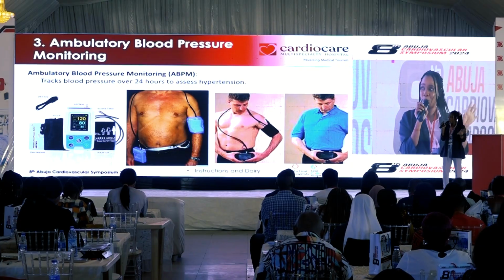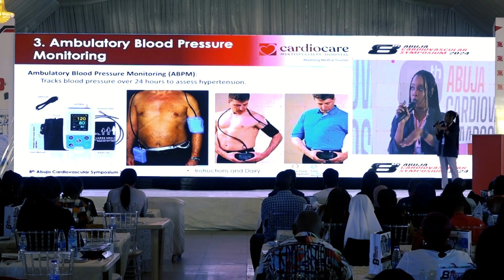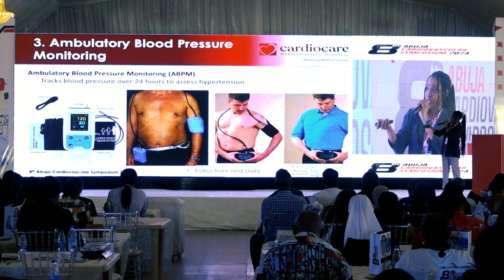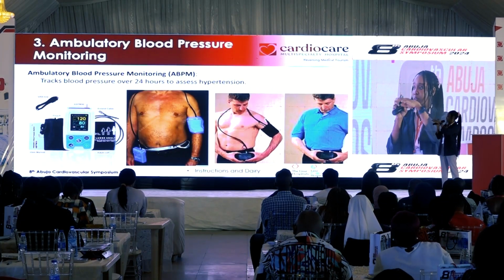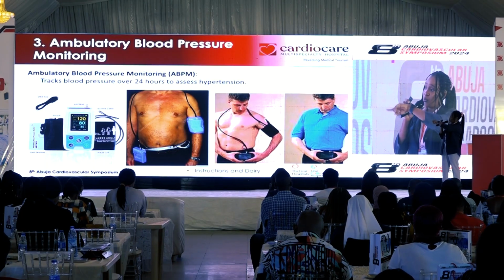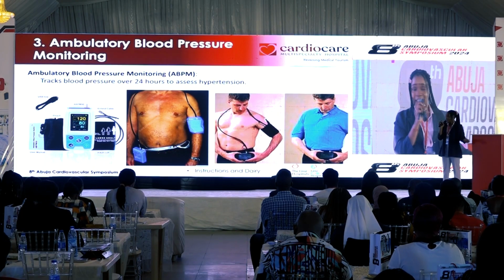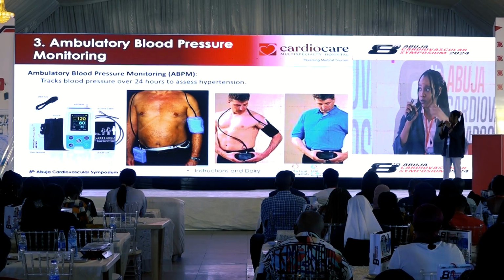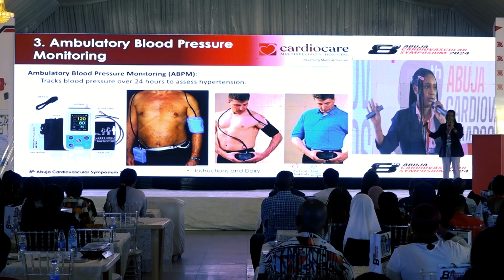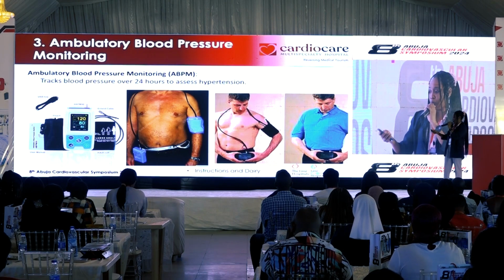Don't worry, we have a solution for you. Just fix your blood pressure monitor and it will monitor the blood pressure for 24 hours. And as you can see, it's pretty much easy. It's not like how you wear your regular blood pressure cuff. You have to strap this on properly so that it's not dangling all over the place and it won't be pulling out. So even when they put on their clothes, they can go about their normal daily activities and everything they need to do.